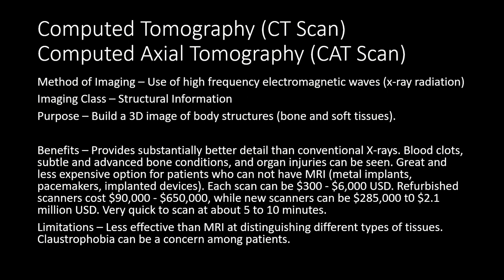Limitations are that these are less effective than MRI at distinguishing different types of tissue. Also, claustrophobia is a concern, because the actual instrument that performs a CAT scan or CT scan can be pretty cramped and scary for those with claustrophobia.